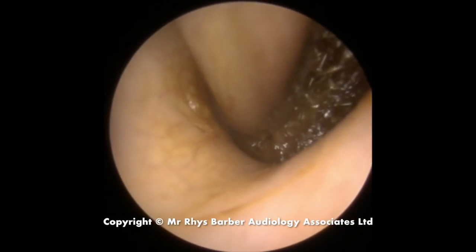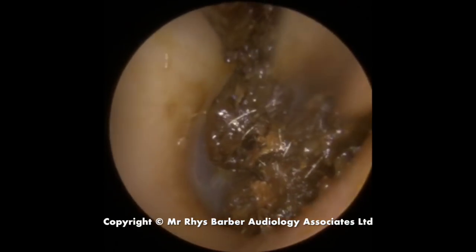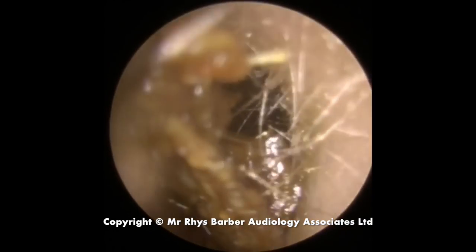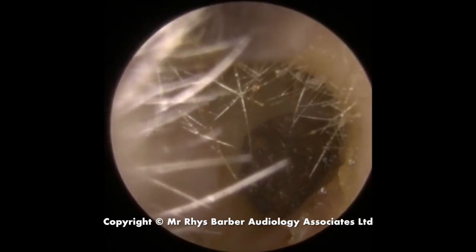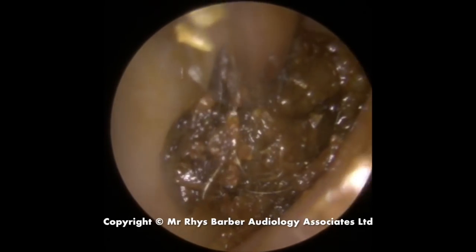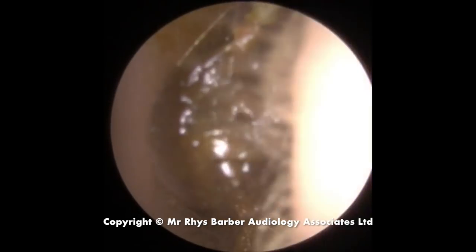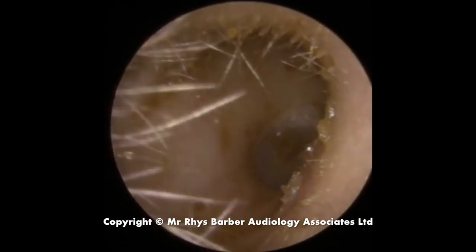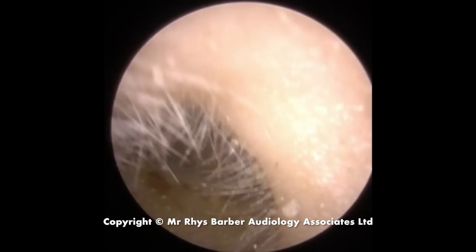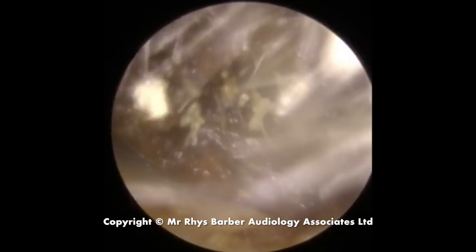We can see the eardrum now, that bluish grey piece of skin at the back of the wax there, that's the eardrum. There we are, you can see it just all coming away now. There's the eardrum there. Okay, similar on this side.